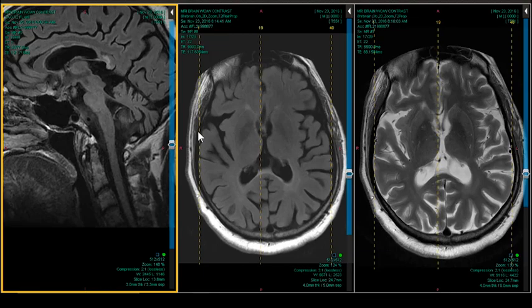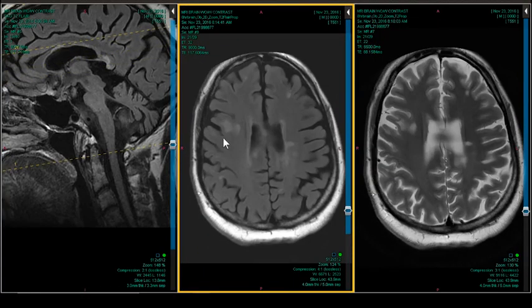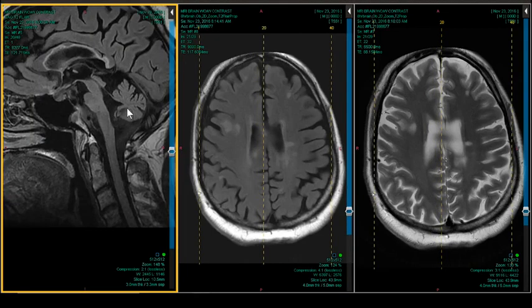So we've really eliminated a lot, and we've also eliminated vascular dementia. There is some white matter disease, but not enough to cause a really severe cognitive decline, and not enough to cause this kind of atrophy. So now we're into something else. And PSP we've already shown, so it's highly unlikely to be that. Plus we don't have the collicular findings, although we do have a hummingbird. We've got a hummingbird right there. In fact, we've got such a good hummingbird we could put a feeder out there.